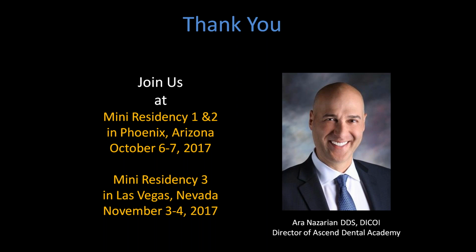Would you say a little bit more about the treatment options? You mentioned we have these implants and parallel implants, and I'm not sure I got the difference. Sure. A parallel implant doesn't have a taper. When implants don't have a taper, they don't have as good fixation because you're placing a parallel implant into a parallel hole. That's one area where the literature shows that a tapered implant works much better.